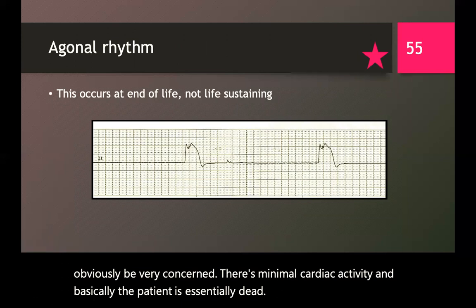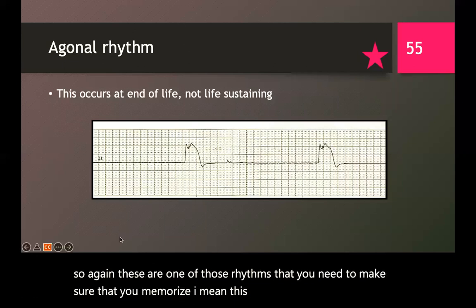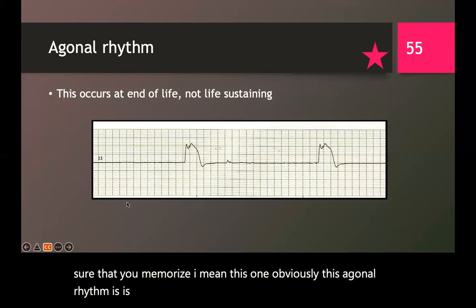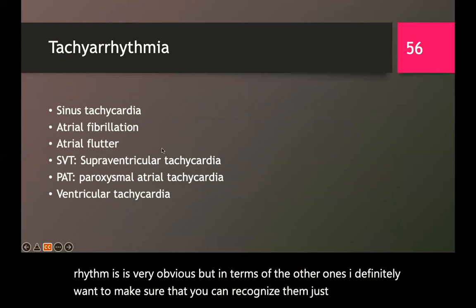So again, these are one of those rhythms that you need to make sure that you memorize. I mean, this agonal rhythm is very obvious, but in terms of the other ones, I definitely want to make sure that you can recognize them just by looking at a basic strip.